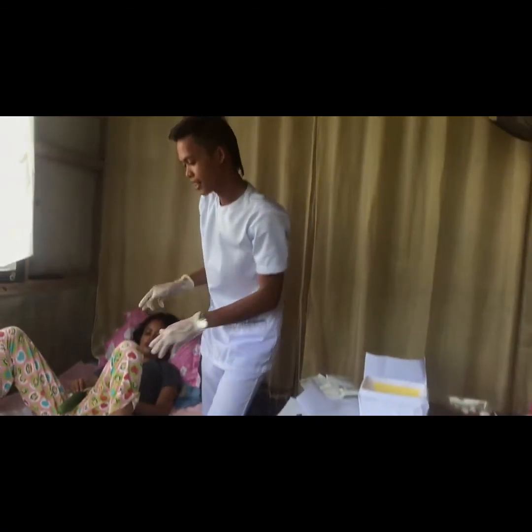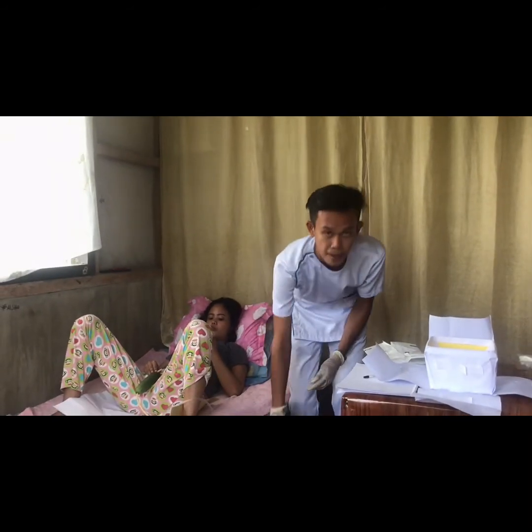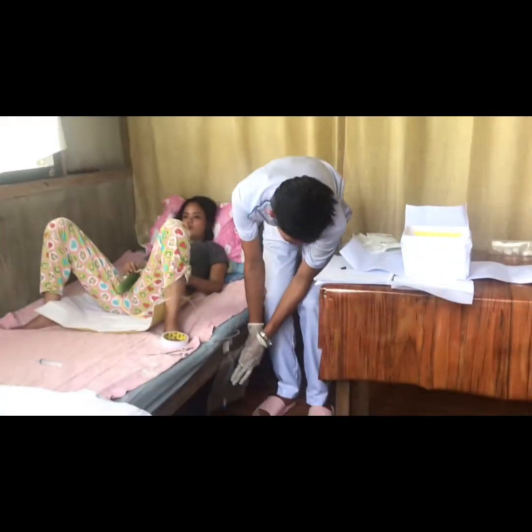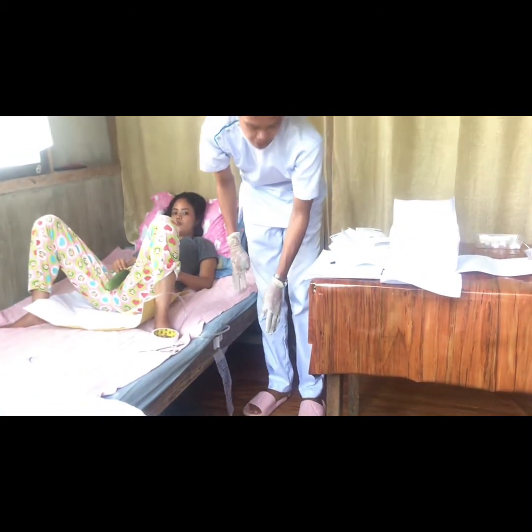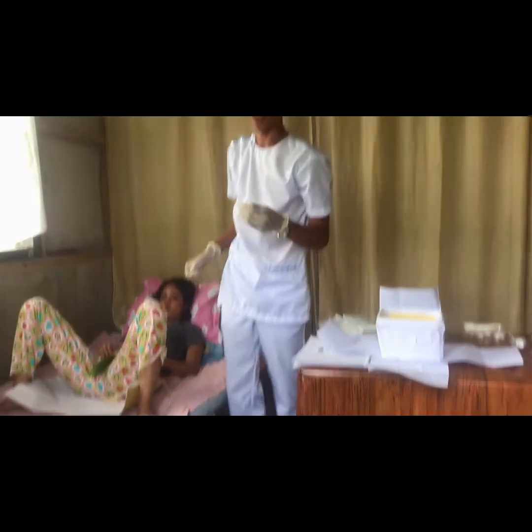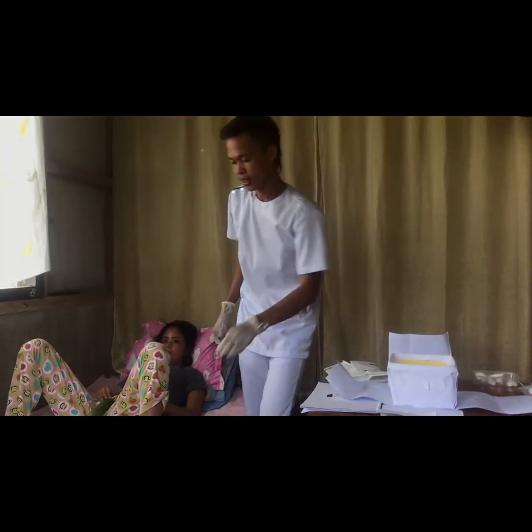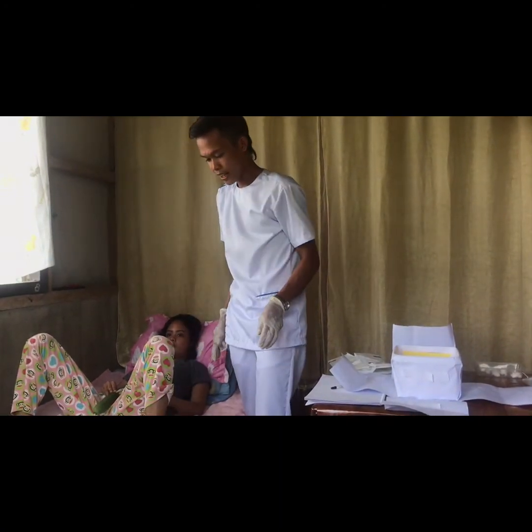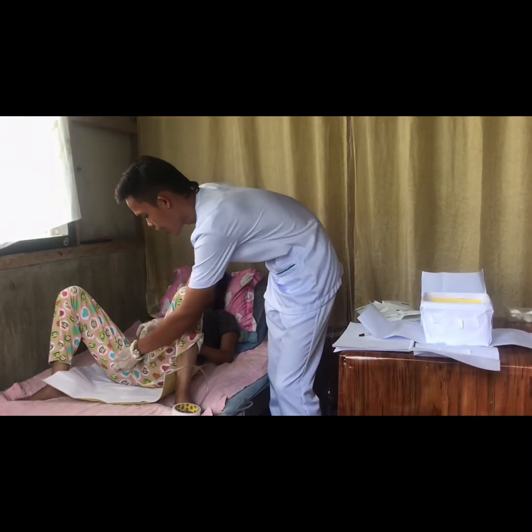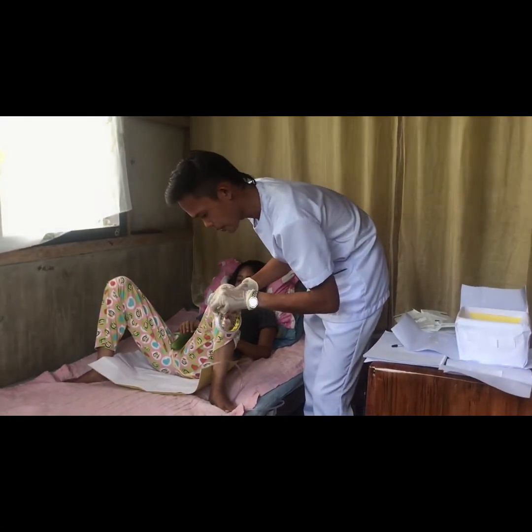Okay. Observe also the lining of the tube to see if urine is flowing towards the urine bag, and observe the urine inside the bag if there is urine inside, and we're going to note the characteristics, the texture, the color of the urine, the volume itself. And then we're going to set it aside. And then this time, I'm going to attach the stat-lock stabilizer to the patient in order to make the patient more comfortable. Are you okay, sir? Yes. Okay. I'm just going to insert the stat-lock in order to make you comfortable.